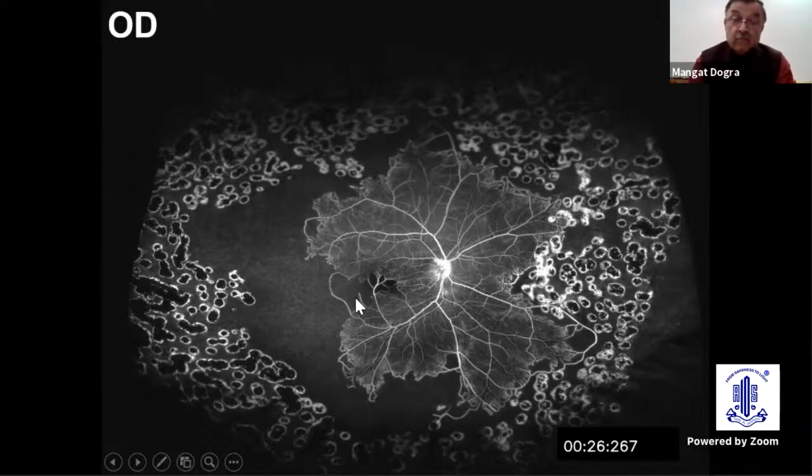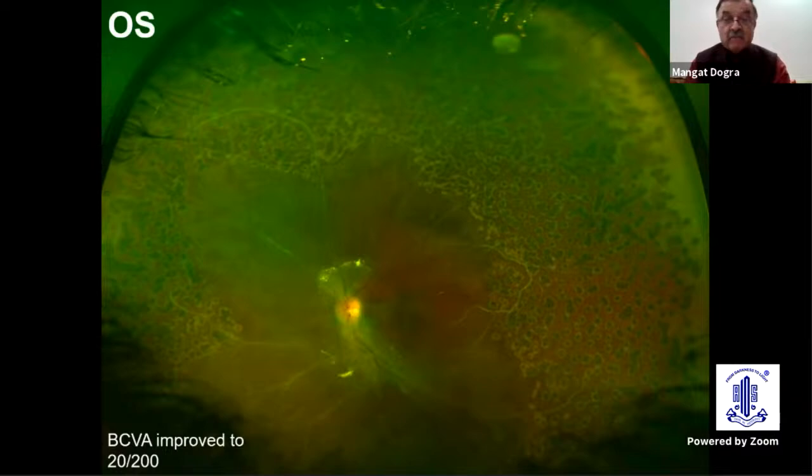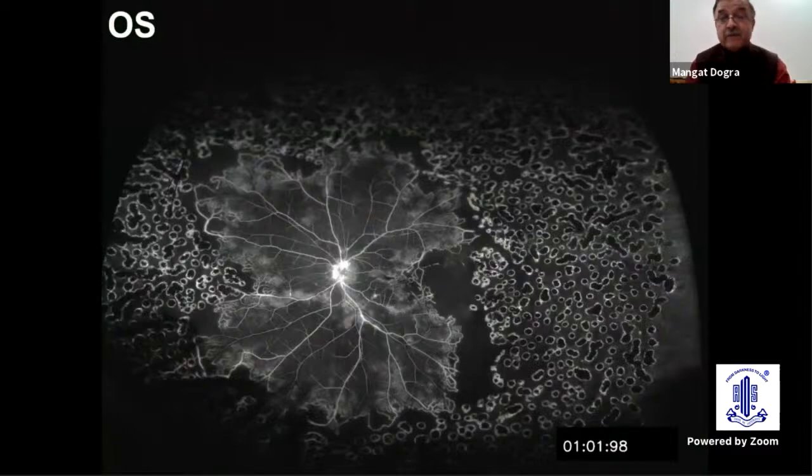What was surprising is that this girl is seeing 20/30, 6/9, and there is some macular ischemia here. Despite this, she's seeing that kind of vision. So I think this kind of documentation is not possible without this kind of ultra-wide field imaging. And this is the other eye, same way, where partial pars plana vitrectomy was done. You can see extensive laser done, sclerosed vessels. And look at the angiogram.